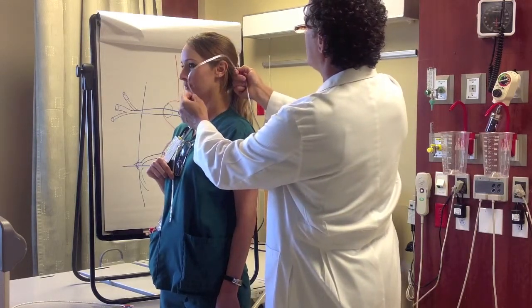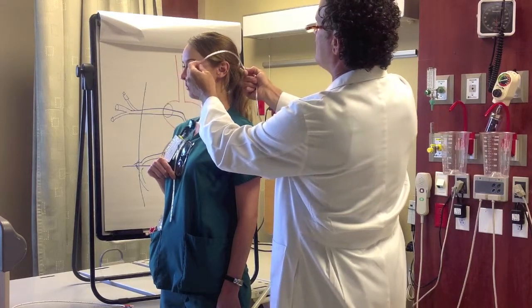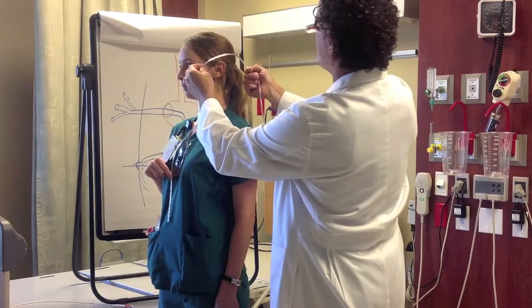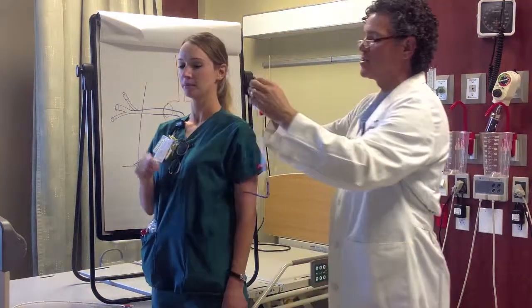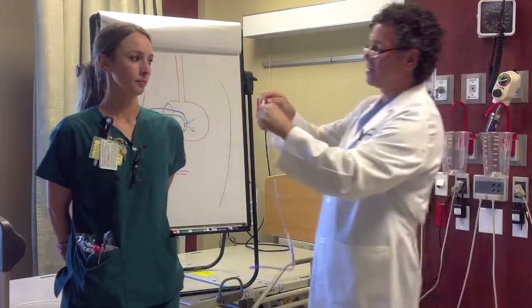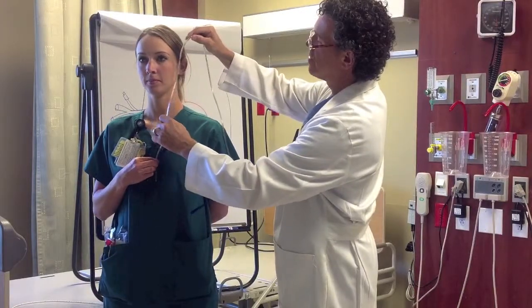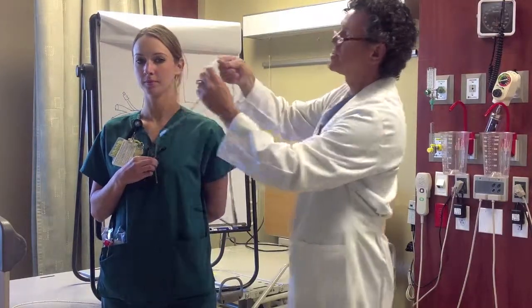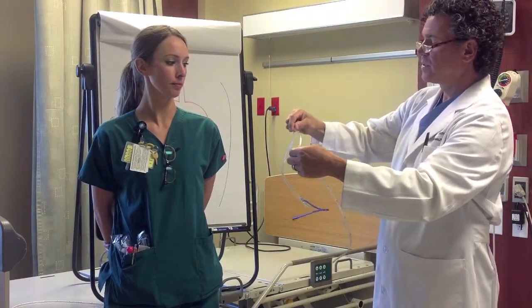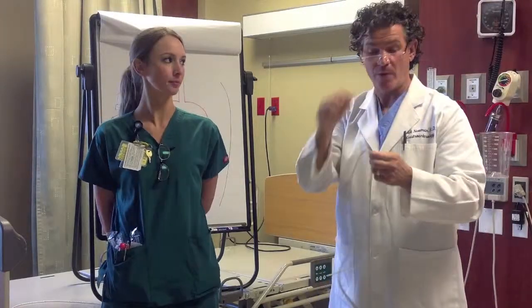So ideally, you'd like to get this tube down somewhere between where it is at the nose and where it is here at the ear, 55 to 75 centimeters. And so that gives you an idea when you're placing this thing down. If you only put it down to here at the nose, you're probably not going to be all the way in the stomach. So it needs to be advanced somewhere between 55 and 75 centimeters to the 75 centimeter mark. That's at the nose, okay, at the nose.